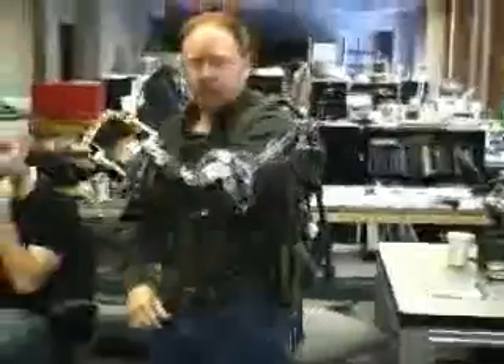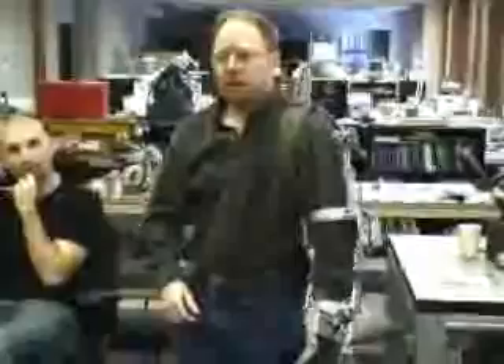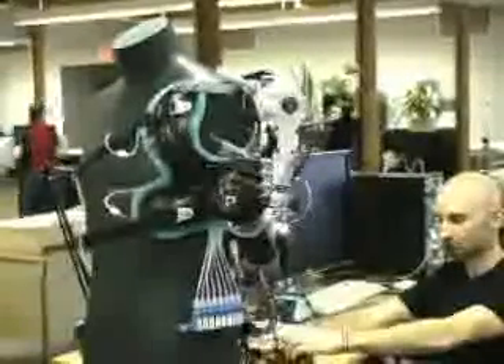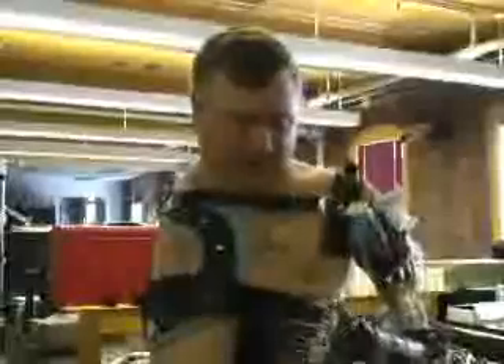The electronics support a variety of inputs. Depending on the user, the arm can be controlled by nerves, muscles, or even foot pedals. For example, pushing on the little toe moves the hand down, while using muscles switches the mode. Pushing on the ball of the foot rotates the wrist, and pushing on the other side rotates it back.